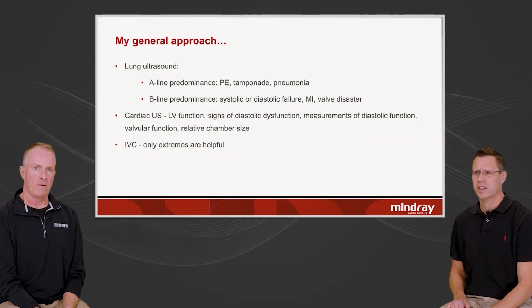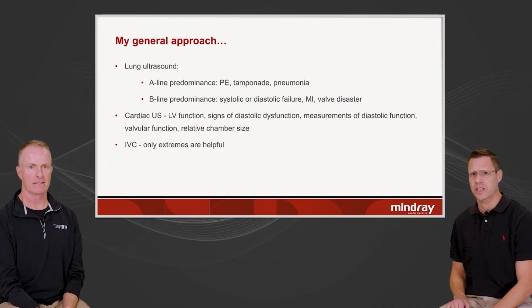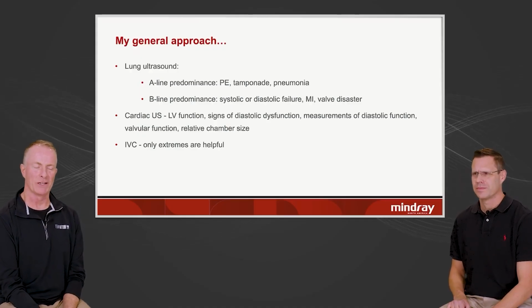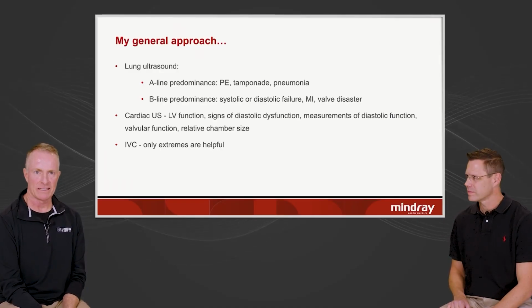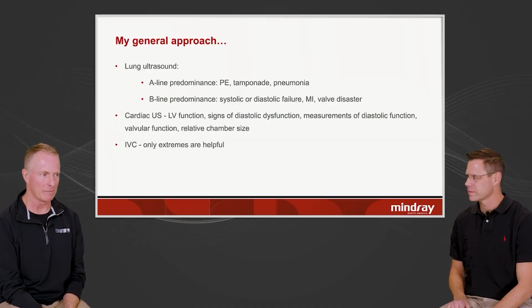And just completely relying on x-rays, which are horribly unreliable at the bedside, the portable chest x-ray for pulmonary edema, pneumothorax. Yeah, if you start looking at B lines and looking at chest x-ray interpretations, it's kind of sad. I've noticed just in the last year that I've seen people with really no B lines anywhere, and their x-ray is read as, consider pulmonary edema or something like that. They just don't have pulmonary edema as their problem.